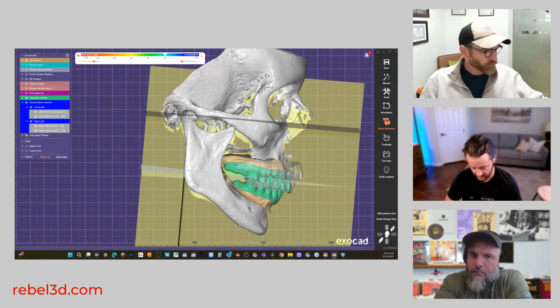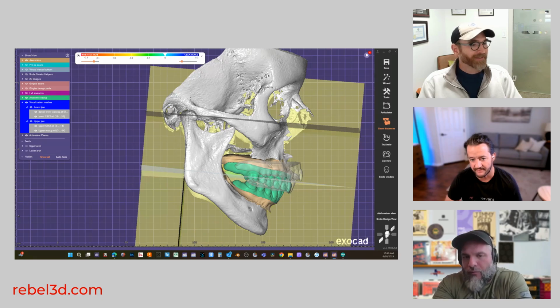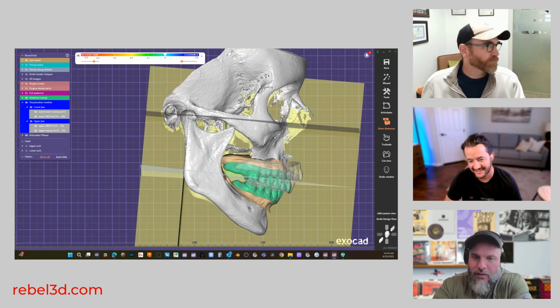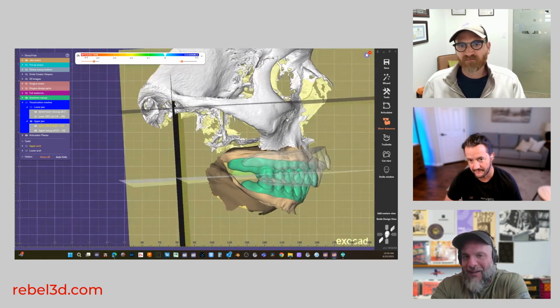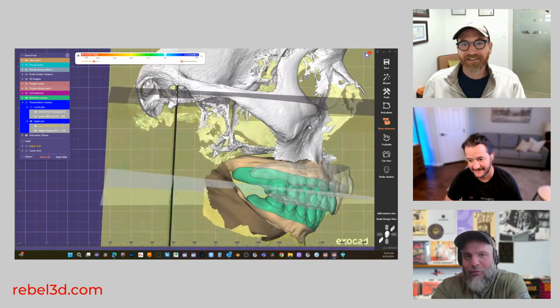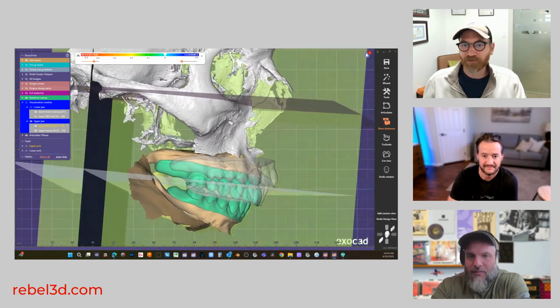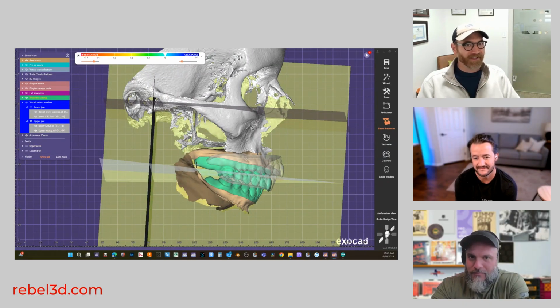Daniel, any more questions just on occlusion for Dr. Sven? I mean, we can be here for hours. Yeah, I think maybe we should do a different episode where we get deep into the technicalities of occlusion. Right. I'd rather not get into it right now, because it'll stretch out the conversation quite a bit. But we've got these slopes, we've got all kinds of geometry here to dive into, man.